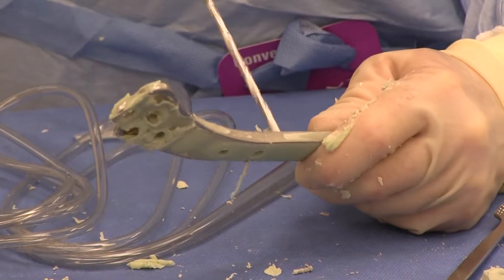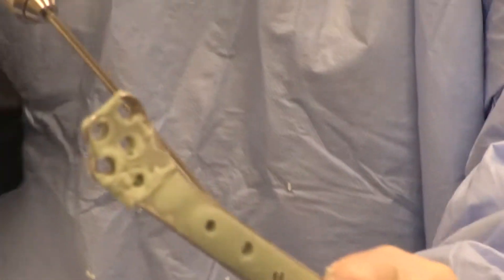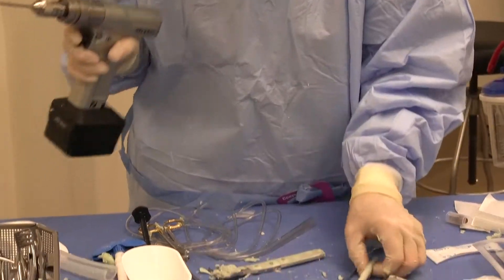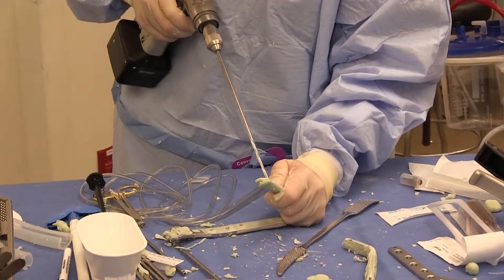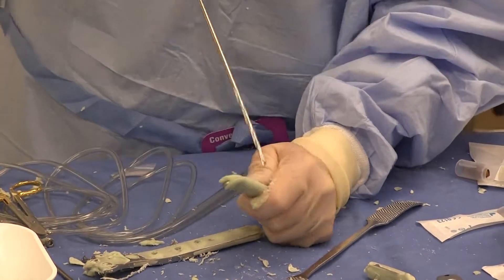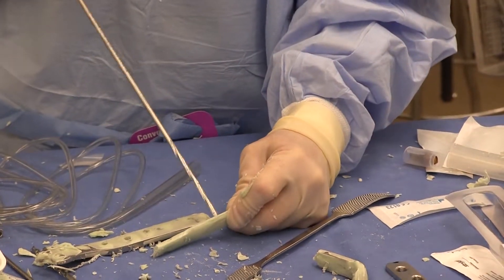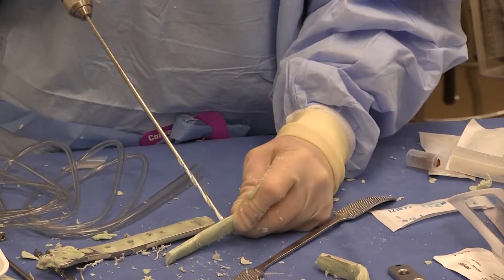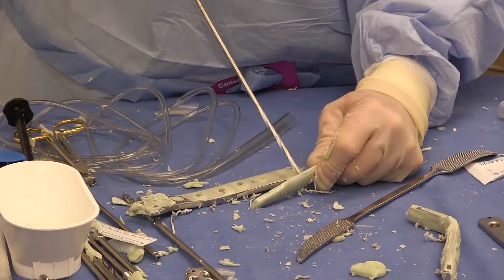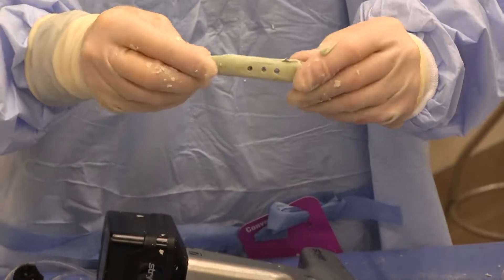It's a pretty good solution to bail you out of a pretty tough jam. I feel like it gets the job done. Good coating on the back side, good coating on the front side. We'll go with the little plate — we can do the same thing, get all our holes out. If you're not going to use those holes, don't even bother cleaning them out. Same type of thing with the small plate — I can go through and drill all these out. You may want to use more than one drill bit because they will get dull.